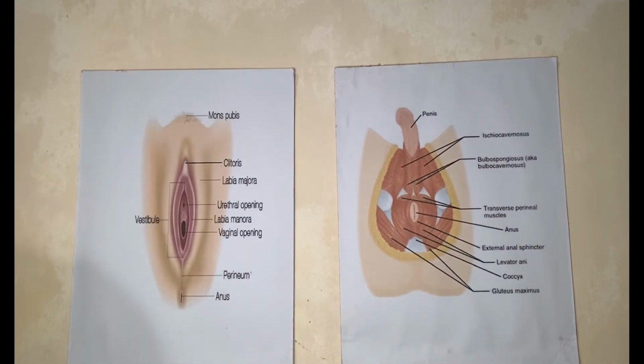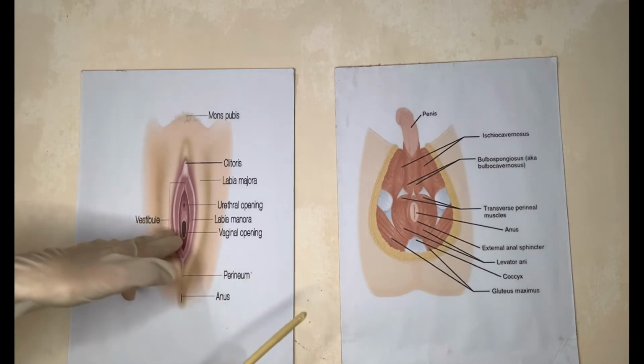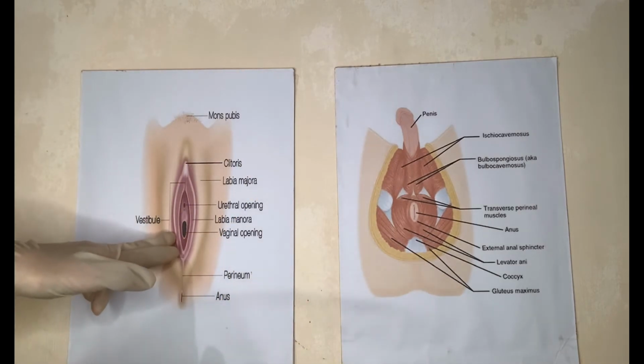For male clients, some experts recommend advancing the catheter to the Y bifurcation of the catheter. Also, check your agency's policy. If the catheter accidentally contacts the labia or slips into the vagina, it is considered contaminated. So, a new and sterile catheter must now be used.